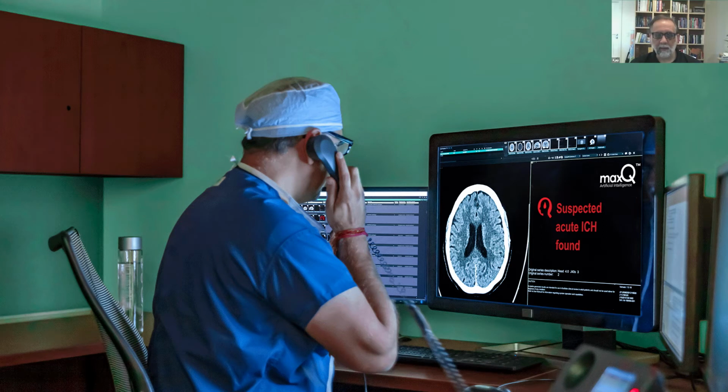Since we have dedicated neuroradiologists in our situation, they may be reading MRIs of the spine, CTs of the cervical spine, or CT scans of the head and neck. So the impact is if there is acute blood on a scan that needs to be looked at sooner rather than later, that's where it shows its true value. It brings that study to a more acute priority, so we read it faster.